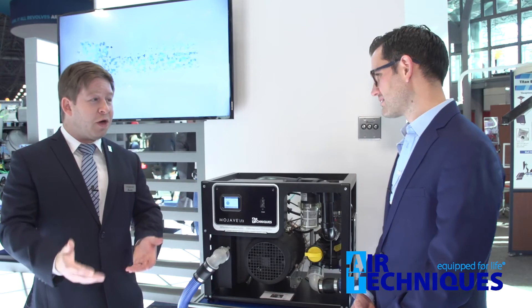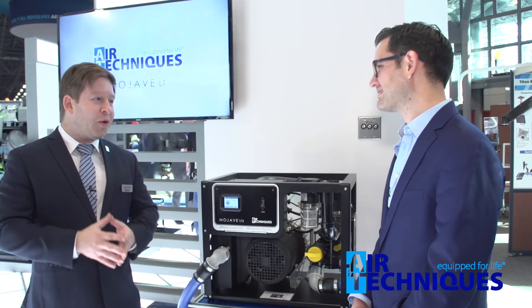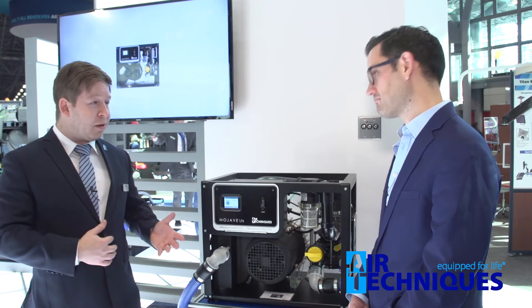Noise is one of the features that dentists notice very much — we want a quiet machine and can't always pay for soundproofing. A lot of times your vacuum system is really close to your operatories or even your offices, so you want a system that's not going to annoy your patients or workers. This unit uses our proprietary sound-reducing impeller with offset veins to make sure it's a really quiet system that's still just as powerful and compact.